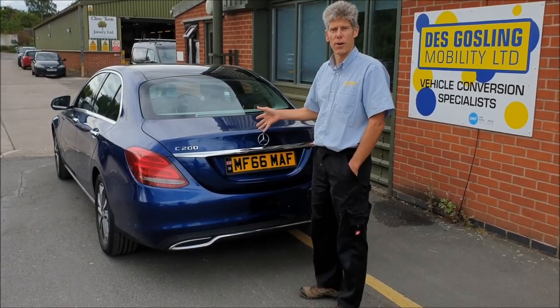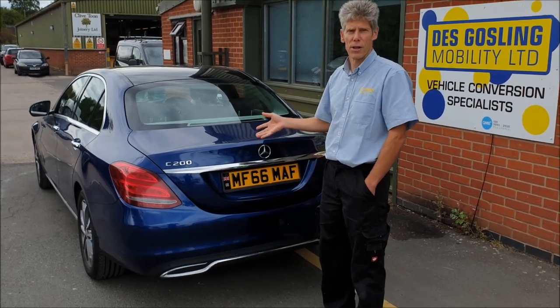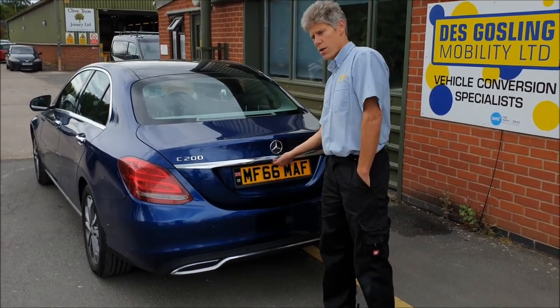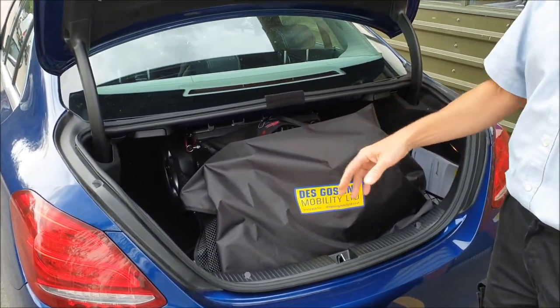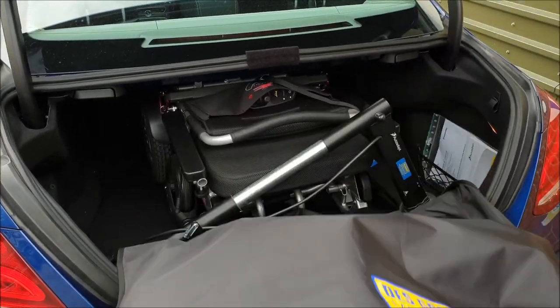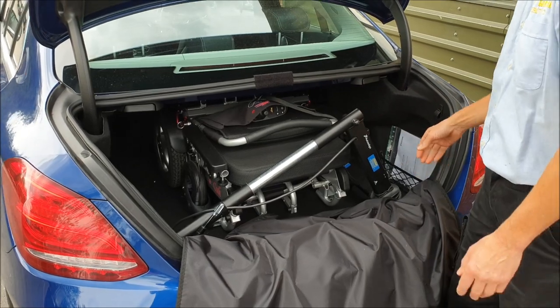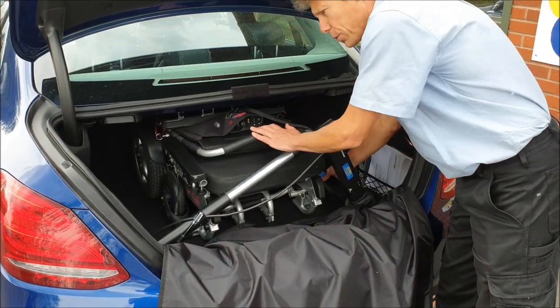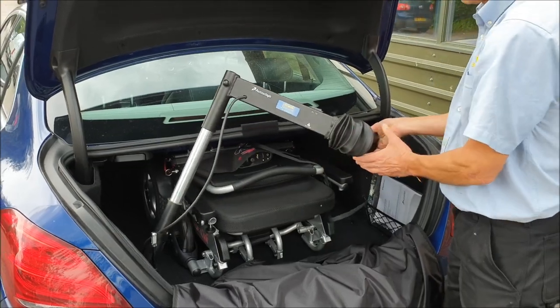I'll just show you this hoist we've done in this Mercedes C200 saloon car. It's quite unusual because it's not really a very big boot space, so it fits this nippy little 40kg hoist and this folding electric wheelchair — it's a Freedom Chair.